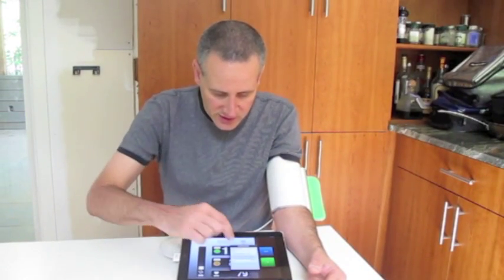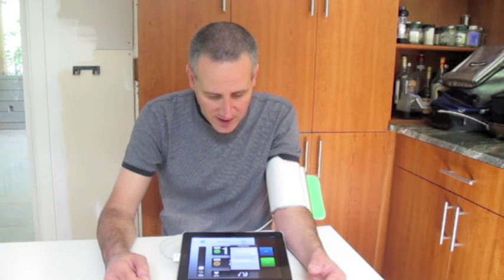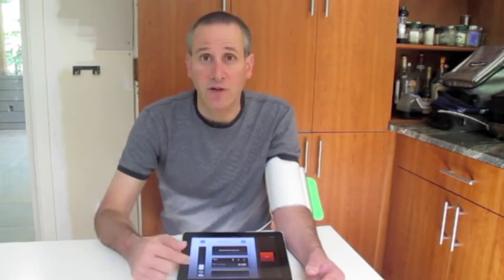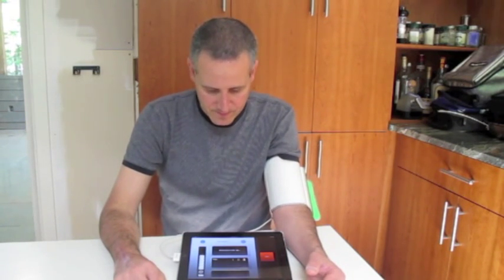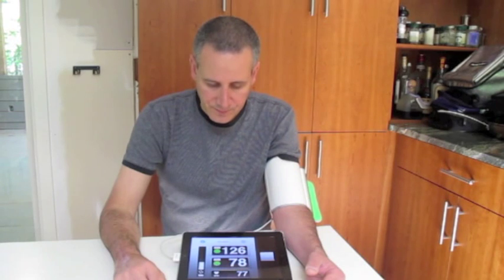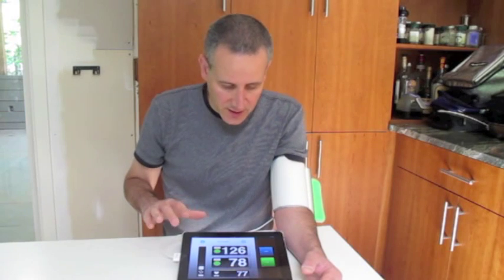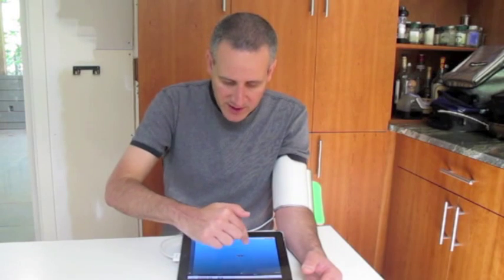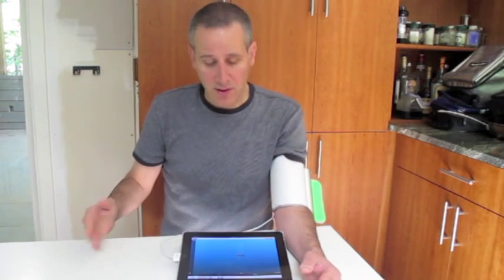Over here you can actually see auto mode. In automatic mode, the device takes three consecutive readings and calculates the average. So let's do automatic mode. And so it averaged it out. Now that it's done, I'll just press the button done, and it gives me the reading. As I take more readings, it'll give me a record of how my blood pressure is when I check it morning and evening going forward.